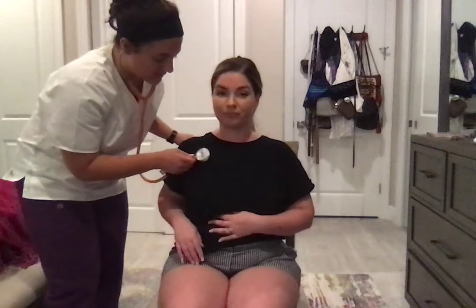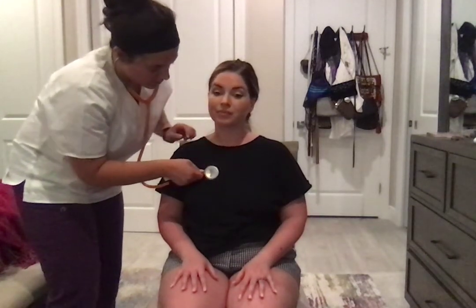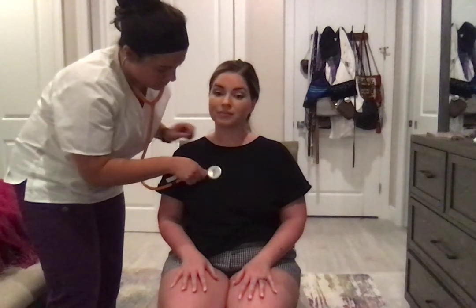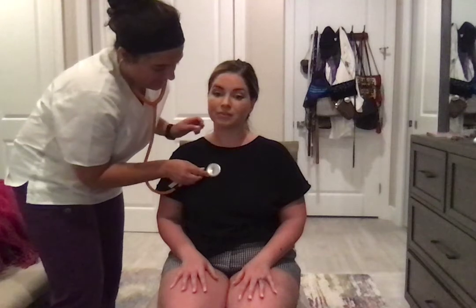Okay, and now I'm gonna do it with the bell as well. So, second intercostal down. Okay.